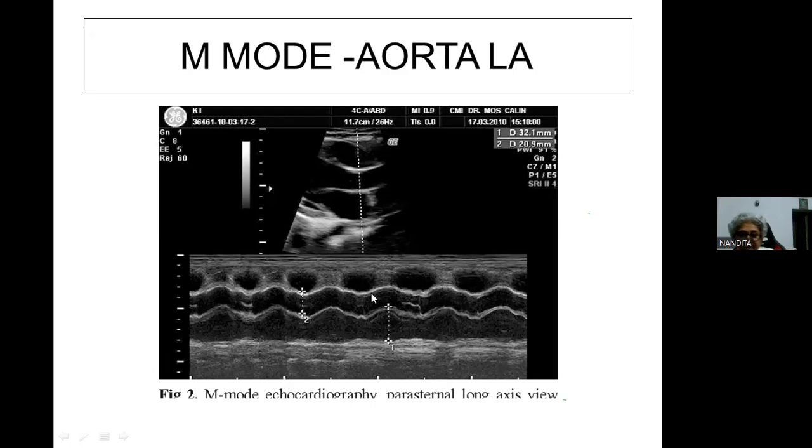There are so many cardiac cycles. Now choose whichever you like, whatever you feel is a good delineation of the desired image. Am I clear? Okay.